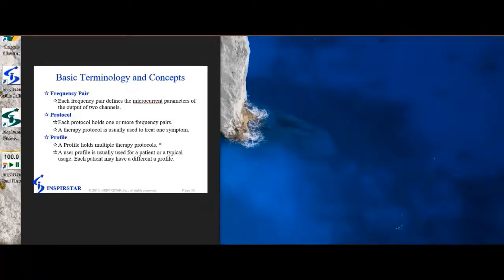Frequency pair. Each frequency pair defines the microcurrent parameters of the output of two channels. Protocol. Each protocol holds one or more frequency pairs. A therapy protocol is usually used to treat one symptom. Profile. A profile holds multiple therapy protocols.